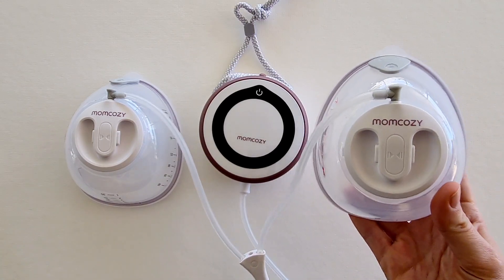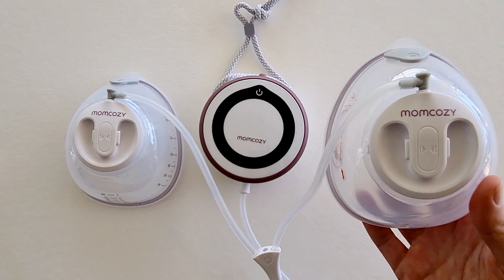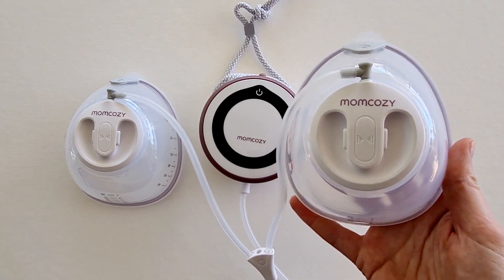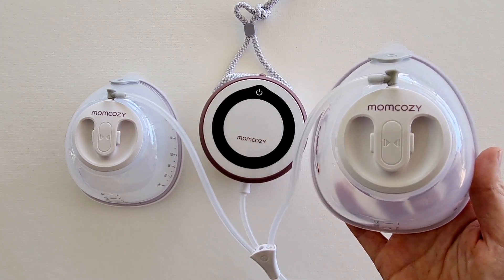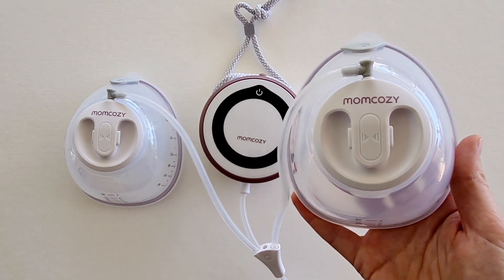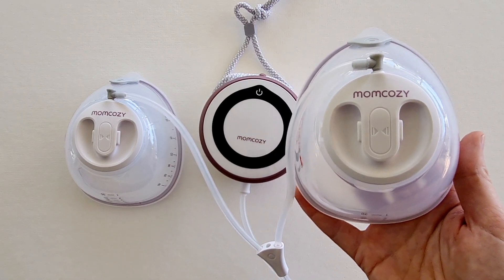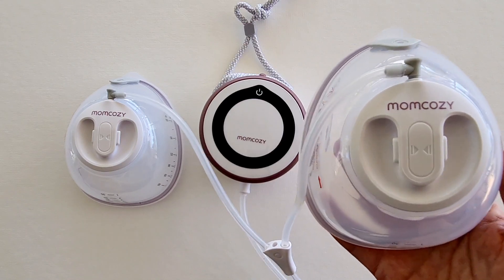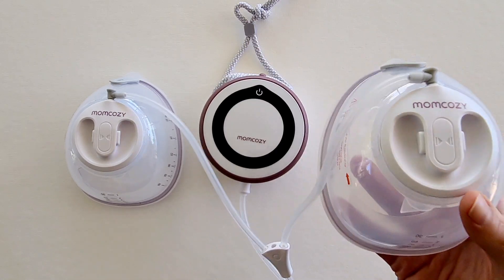There are also three different modes: stimulation mode for your letdown, expression for your general pumping, and this incredible vibration mode. The vibration mode offers high and low frequency vibrations to loosen the milk ducts during your pumping session. As it vibrates, the milk ducts are shaking out that extra bit of milk, so you're really emptying your breasts — and for me, having this extra feature is just an absolute huge win.